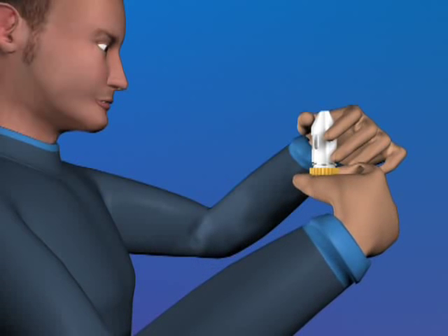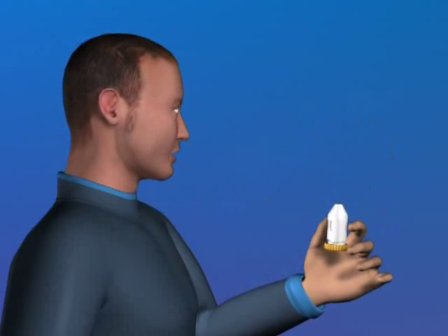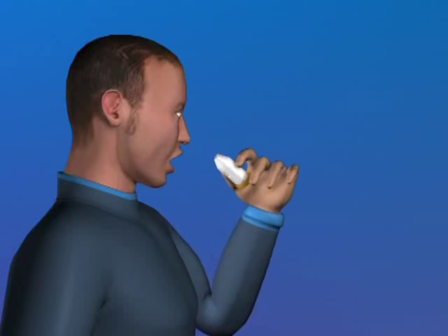If your doctor has told you to take two doses at a time, load the turbohaler as you did before and repeat the process. As the amount of medicine inhaled is very small, you may not be able to taste anything. However, you can be confident that you have inhaled the dose if you have followed these instructions.